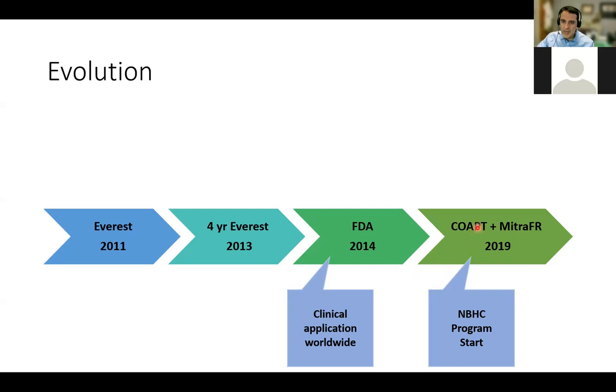And if you remember, on the heart failure side of things, so the functional mitral insufficiency or secondary mitral insufficiency, the COAPT trial and the MitraFR trial came in 2019.